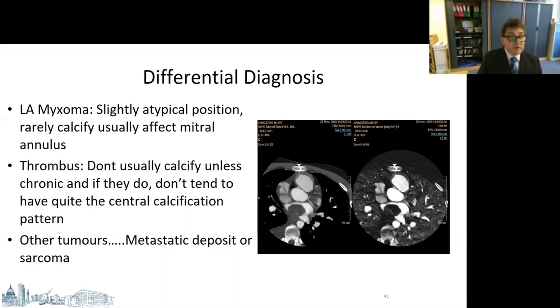Unfortunately, the patient reappeared last week, and recurrence was confirmed on a further spectral CT image.